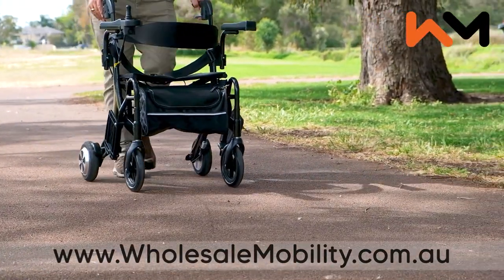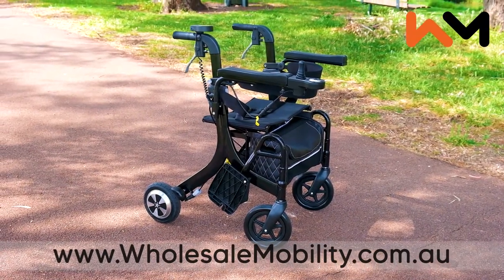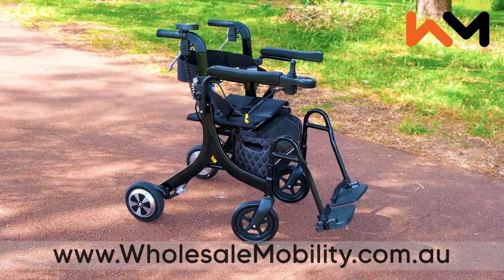Introducing the eTraveler Evo, an electric rollator or push assist wheelchair that transforms into an ultra lightweight electric wheelchair in seconds.